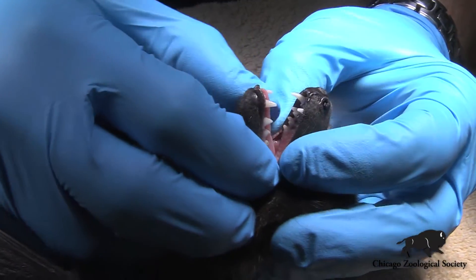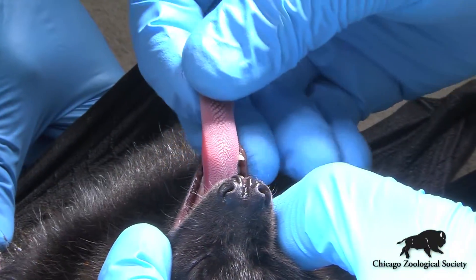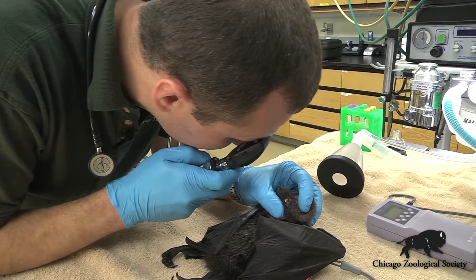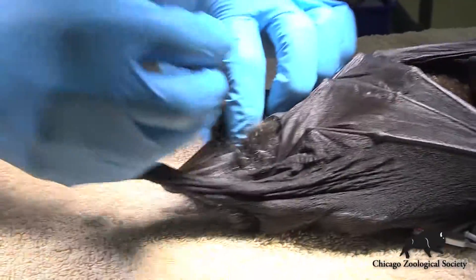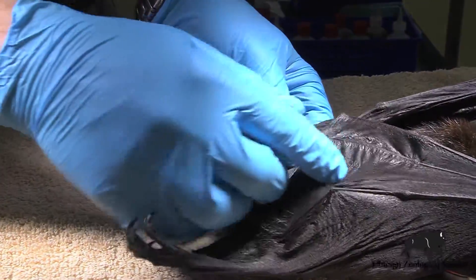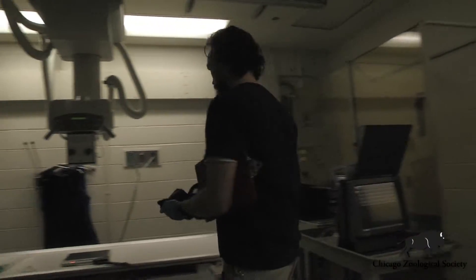We can take a look at all the teeth, which are in great condition in this animal — we're not seeing any tartar or abnormal wear. We'll take a look at the tongue, a good look inside the eyes, the ears, all of the joints, all of the digits. Everything feels really good. These are fairly young animals so they're in great condition right now. I don't really see anything abnormal here at all. We're going to go ahead and move him next door and get a set of x-rays.